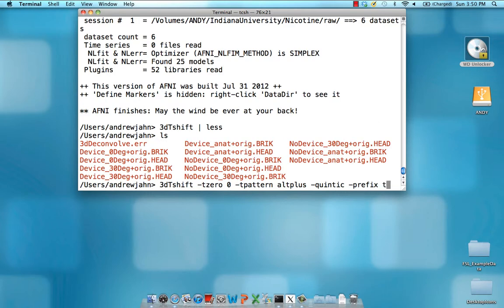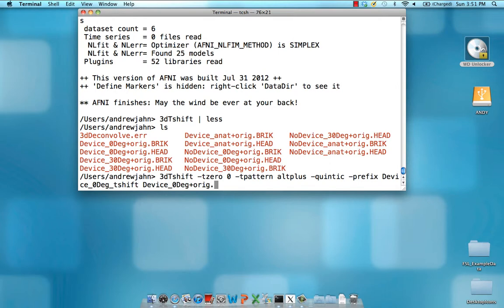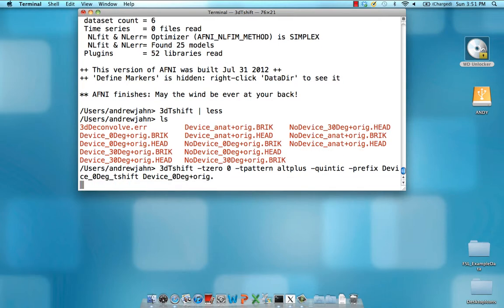Prefix, the name of the output data set. I'm going to call this device zero deg T-shift. And then finally, the very last argument is going to be the name of the data set itself, which is device underscore zero degrees plus orig. Note that I can leave it as is. I can add on head if I need to. AFNI can figure it out either way, as long as you have this plus orig suffix, which tells AFNI what space it's in. In this case, we haven't done any normalization, so it's still in its original space. Now hit enter.